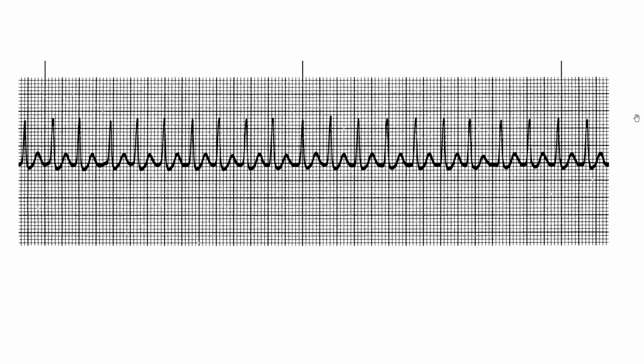You really can't count this one because you can't determine if there's a distinct P wave before each. Here's the distance right here. It's 6 seconds. It's from here and it ends right over here. It looks like you have 190. 190, very good. That is excellent.